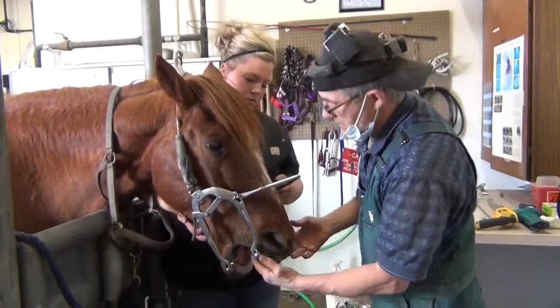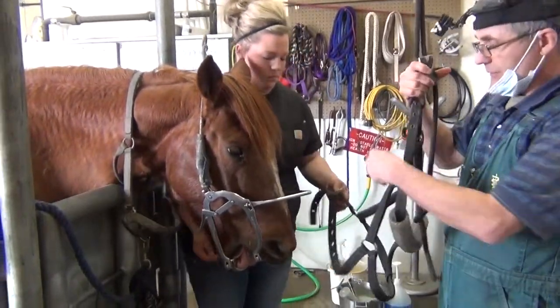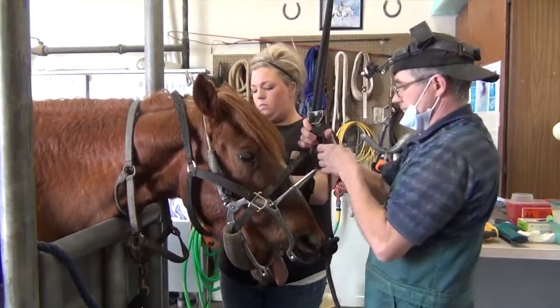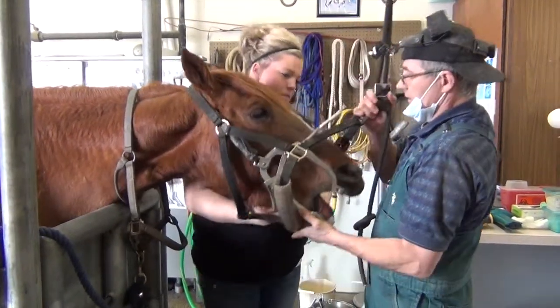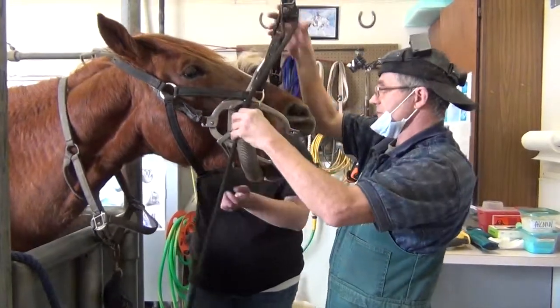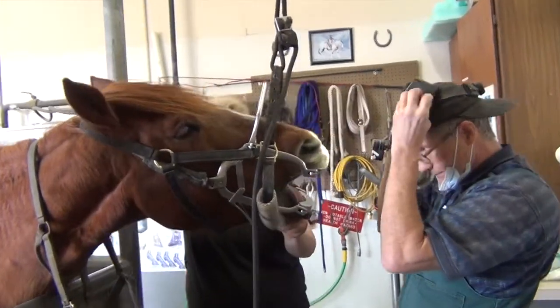Like so. And that's going to give me the ability to look in her mouth and examine her mouth thoroughly, as well as get my hands in there safely. And then we use this dental halter. It just has this plastic tubing on it. And then on the nose band we have this rope that's strung up so that we can hold her head up. Because she's so sleepy, she wants to just let her head stack. This holds it up at the place we can work the best.